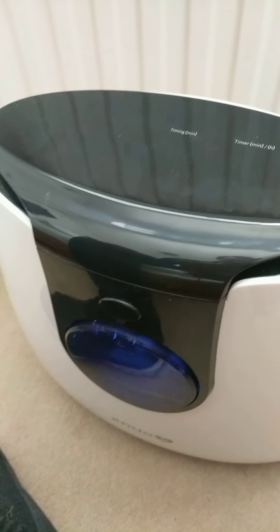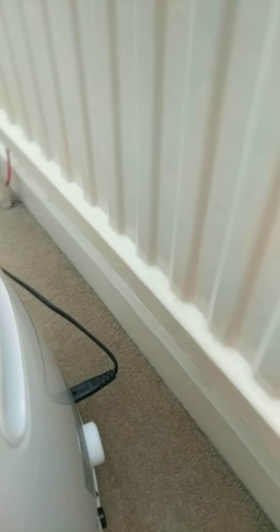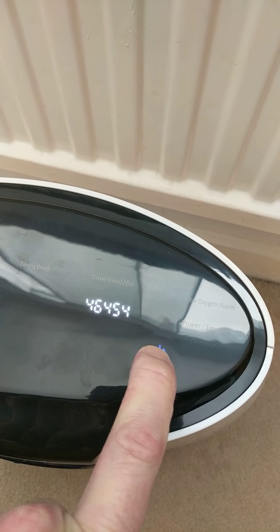Without further ado, it's already plugged in, let's turn on the unit. It's still on the back but there's another power button to press. We'll do this and just hope it works, because a lot of the time you can never get that tank in correctly.